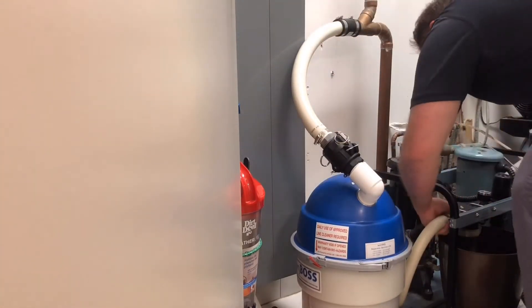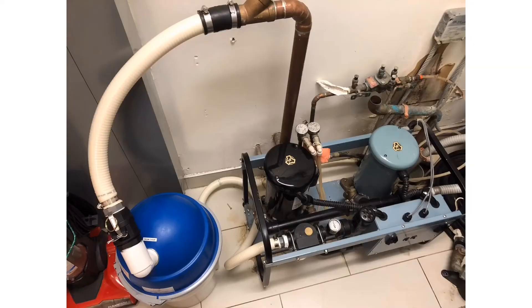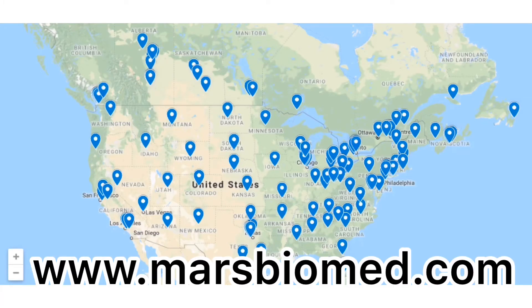The installation of the Mars Liberty Boss in this 8-chair practice took only 15 minutes when using the Mars Upgrade Kit. To upgrade your office, find a trusted Mars distributor near you using our distributor map at www.marsbiomed.com.